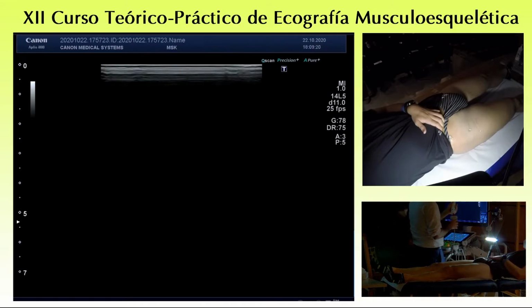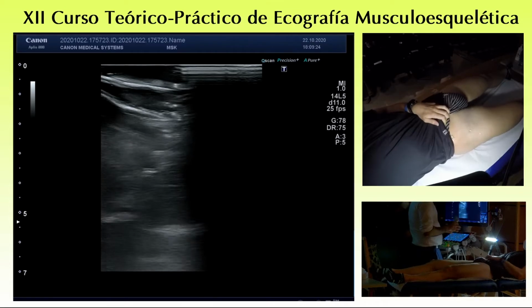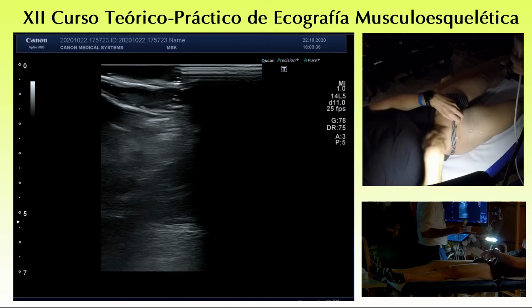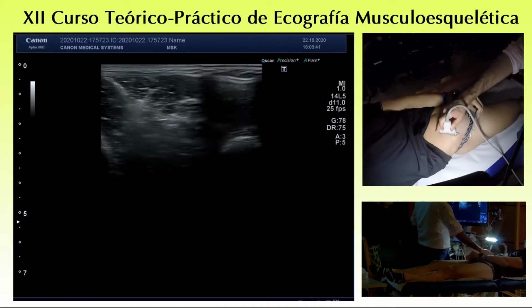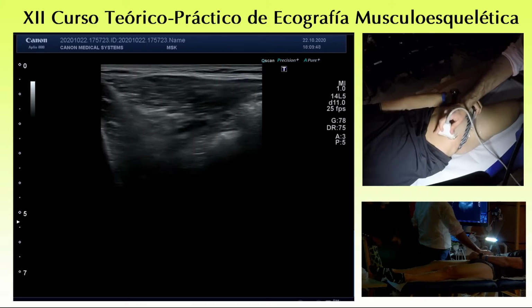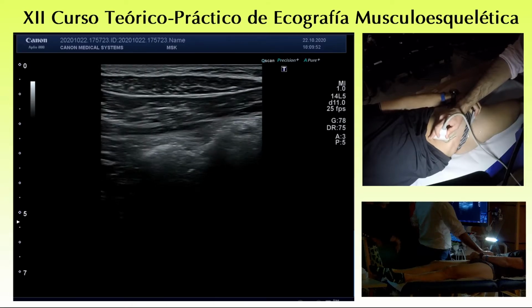we look for the other nerves of the groin area. And for the lateral femoral cutaneous nerve, the anatomy is variable. For the genitofemoral, ilioinguinal, iliohypogastric it is even more so. So, what are the landmarks you have to find? Basically, you have to find the three-layer structure on the abdominal wall.